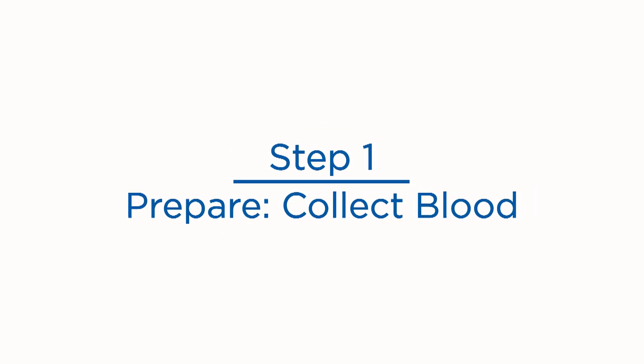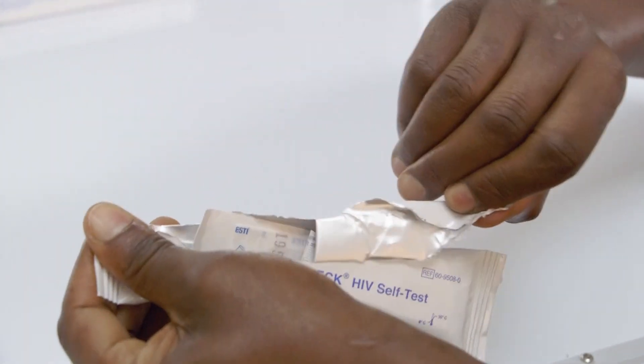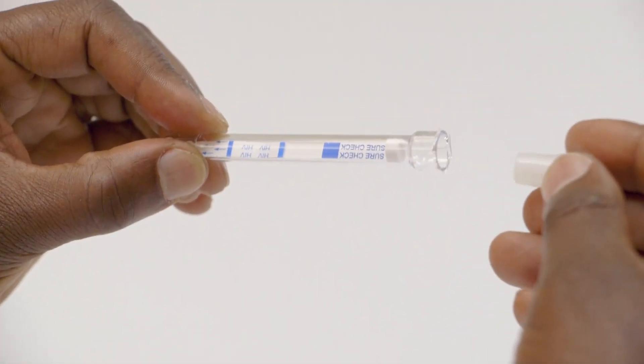In step one, we will collect blood. Tear open the foil pouch. Carefully remove buffer cap. Insert buffer cap into the test stand.